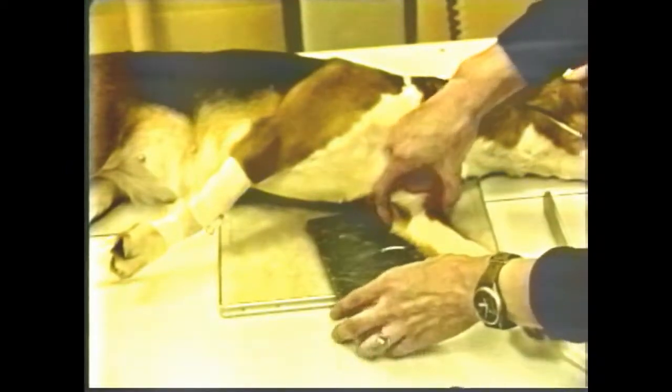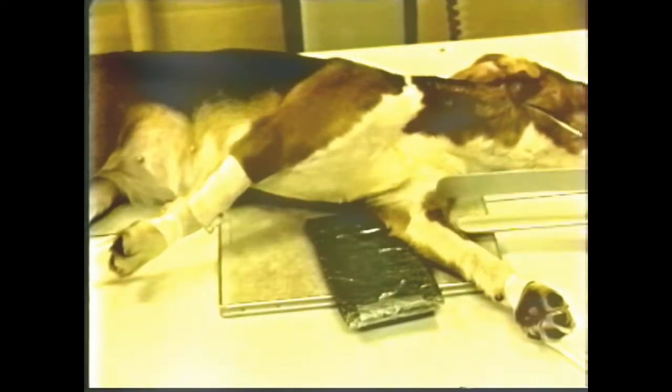The leg of interest is pulled forward. The elbow may be propped up with a sponge under the olecranon. The leg that is not being radiographed is pulled backwards so that it can be out of the way. With tabletop technique, it is easy to split the film so that two exposures can be obtained on each sheet of film. With good collimation, as is being demonstrated here, there is very little scatter radiation which will fog the other side of the film.